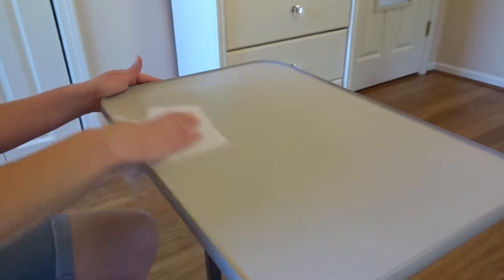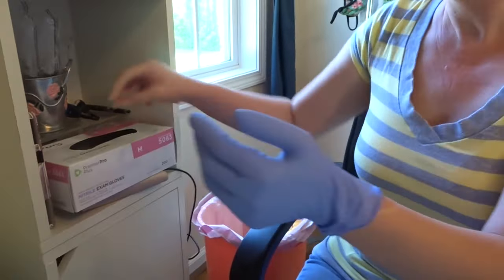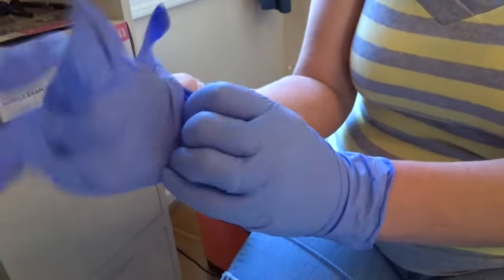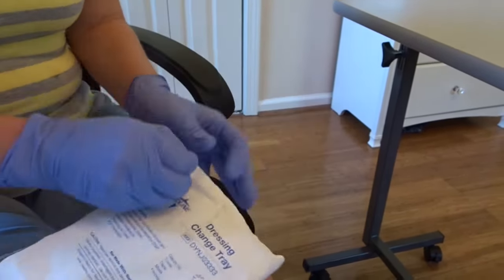The first step in changing the dressing is cleaning off your sterile surface. Once the surface is clean, whoever is performing the dressing change puts on non-sterile gloves. With those gloves, open the dressing kit sent with the weekly infusion supplies from the Home Health Company.